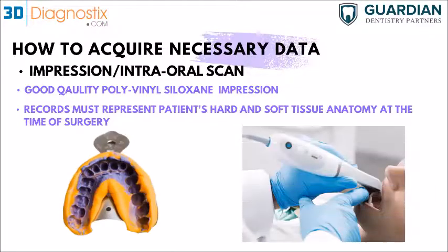And the records, of course, must represent the patient's hard and soft tissue anatomy at the time of the surgery. So that's also one thing that is really important: if the patient is going to have any crown work done, you need to make sure that you wait until the crowns or whatever the restoration is done. Then you take that impression, because that's going to represent the recent anatomy for that patient. And when we have a guide processed, we make sure, of course, that the guide is going to seat on the existing anatomy.